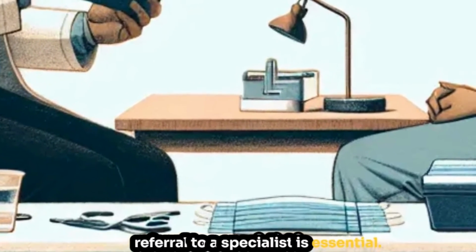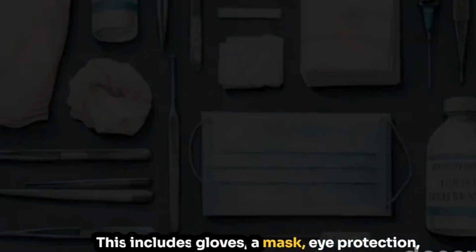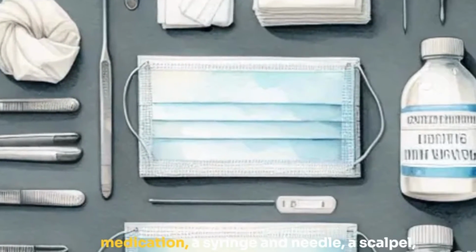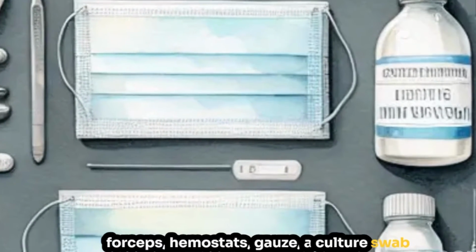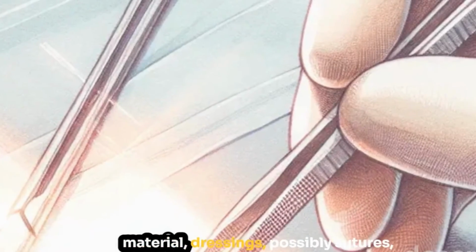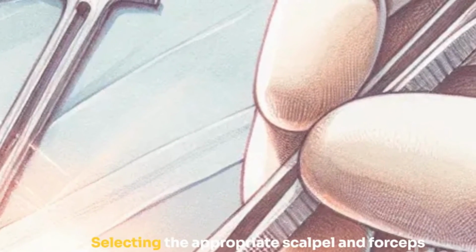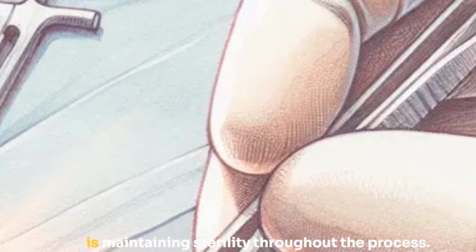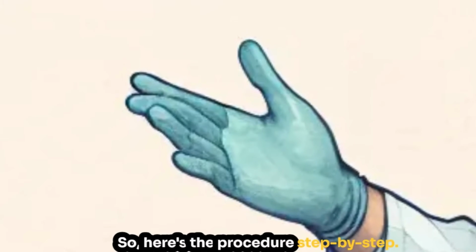For the procedure, having the proper tools is essential. This includes gloves, a mask, eye protection, skin prep materials, sterile drapes, numbing medication, a syringe and needle, a scalpel, forceps, hemostats, gauze, a culture swab if needed, irrigation solution, packing material, dressings, possibly sutures, suction devices, and a reliable light source. Selecting the appropriate scalpel and forceps while ensuring excellent lighting is critical, as is maintaining sterility throughout the process. So here's the procedure, step by step.